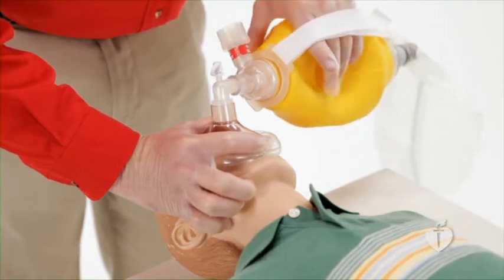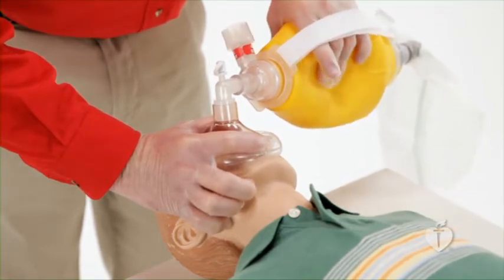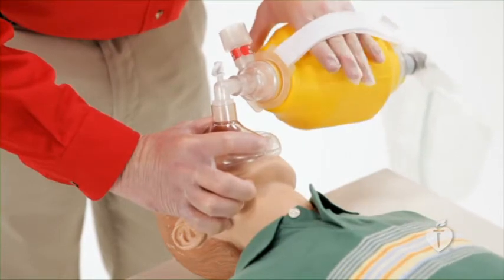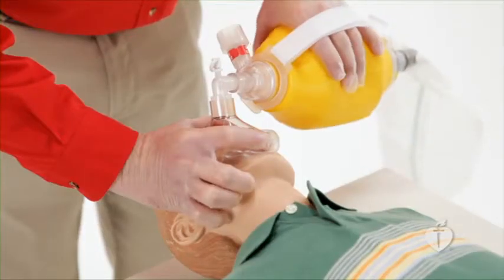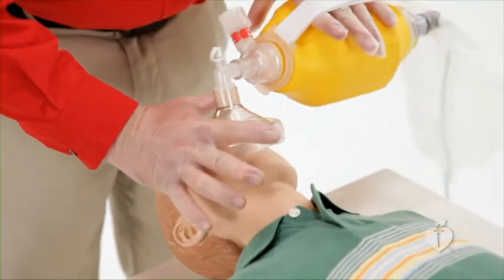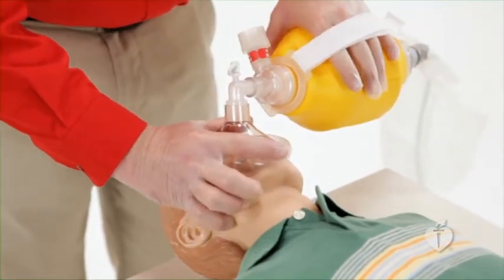Squeeze the bag with your other hand to deliver just enough breath to make the chest rise. Deliver each breath over 1 second. If the chest doesn't rise, then you are not providing adequate breaths. Adjust the mask, reposition the head and neck, or administer a larger amount of air.